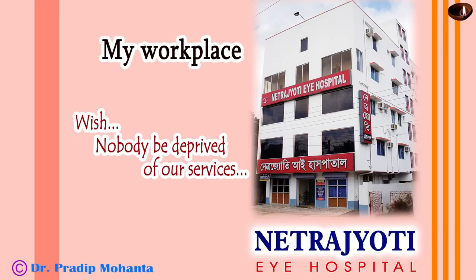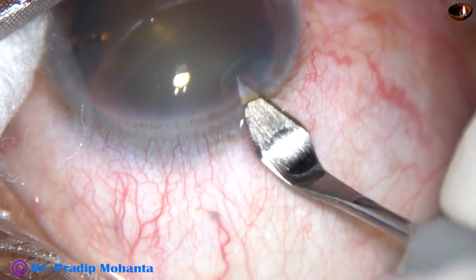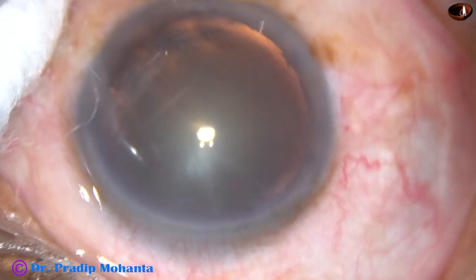Friends, welcome to my workplace at Ranaghat, West Bengal, India. In this video, I am going to demonstrate the carousel technique of phacoemulsification for soft cataracts.